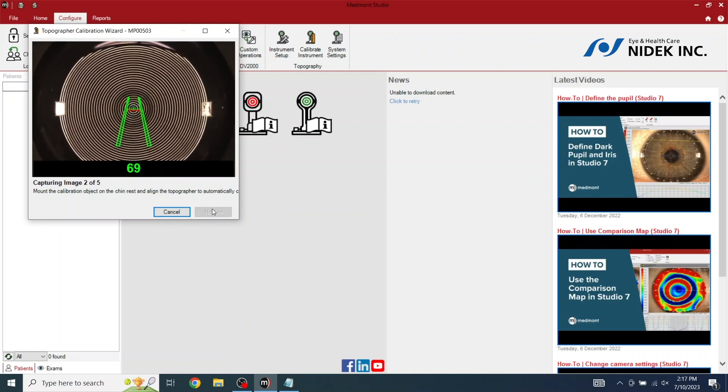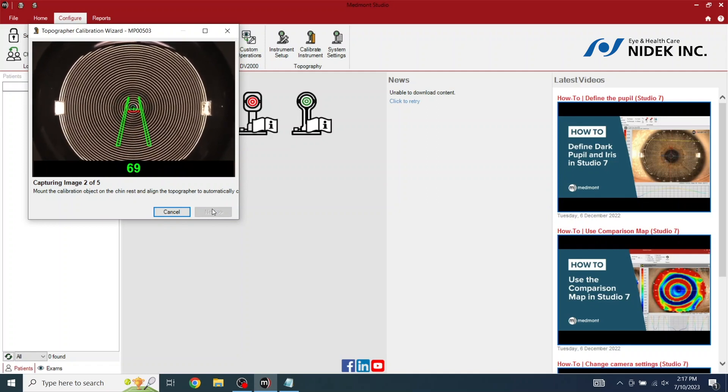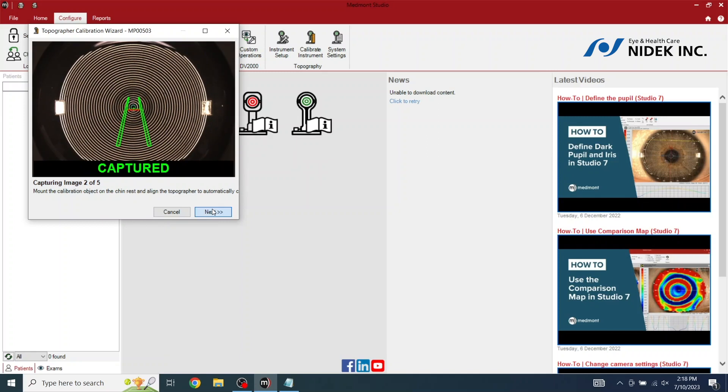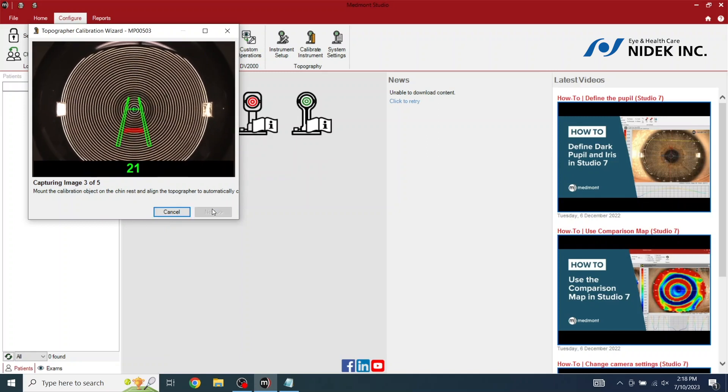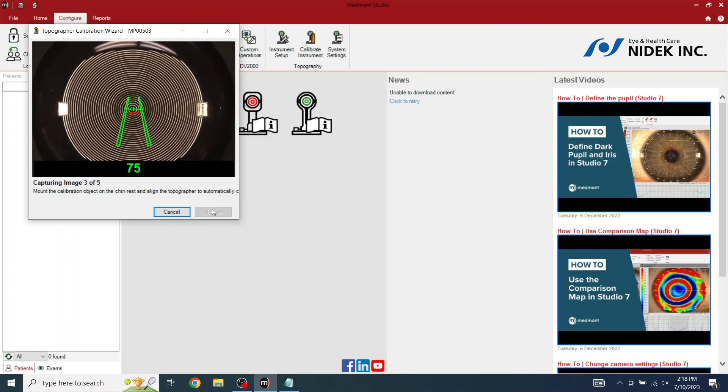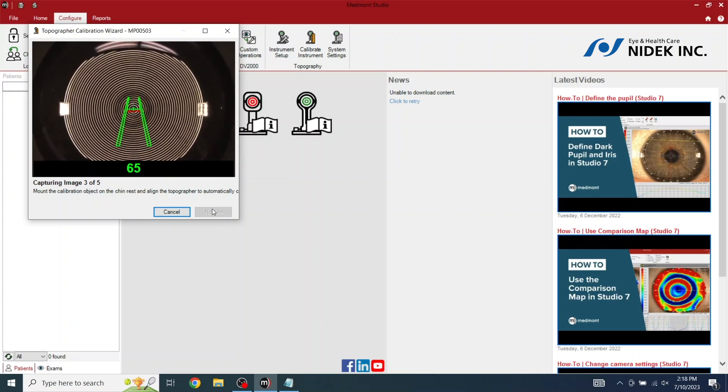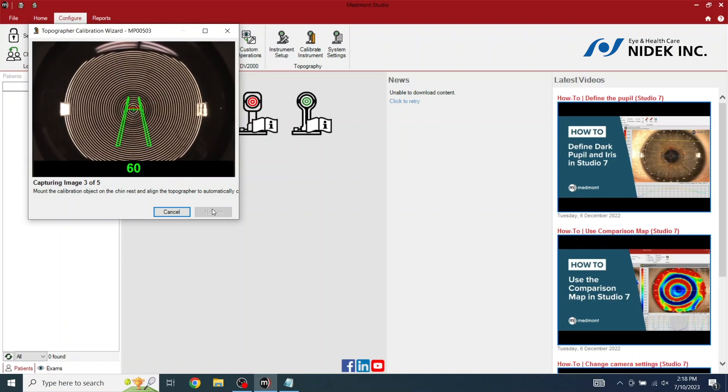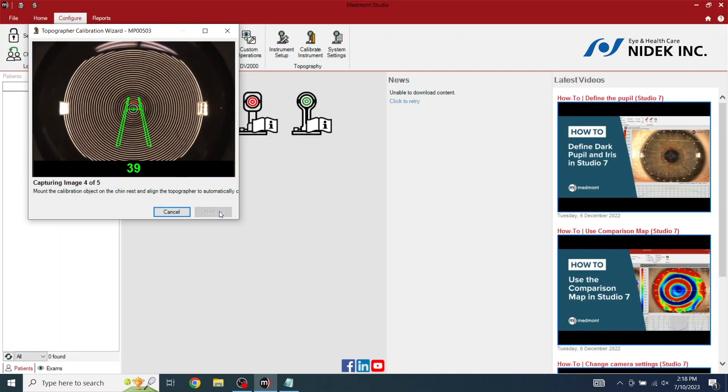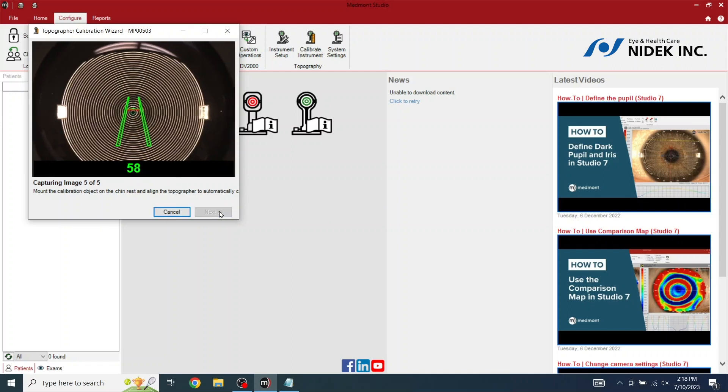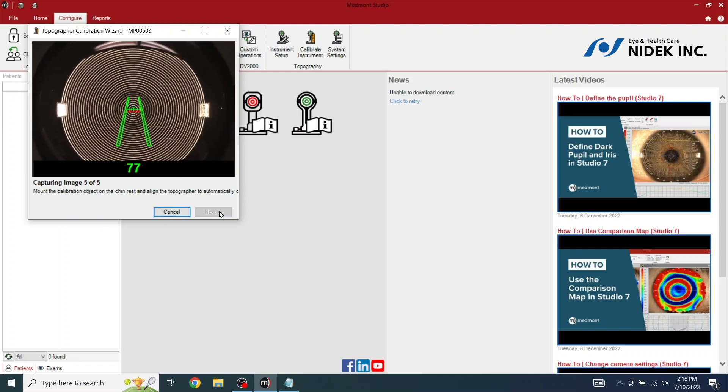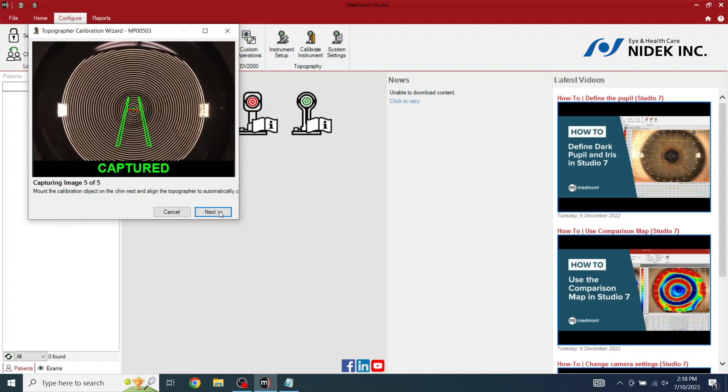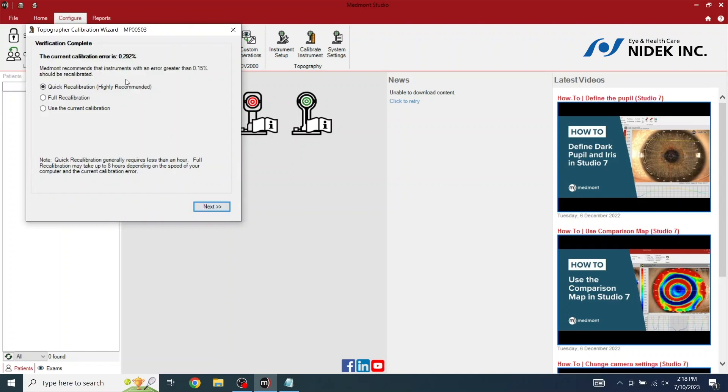Minor adjustments. Minor adjustments. It will automatically capture the images. And next. And one more. We are going to do a quick calibration, click next.